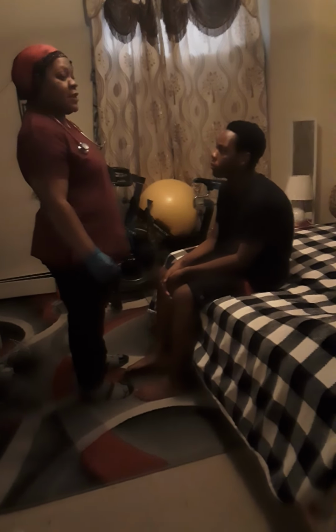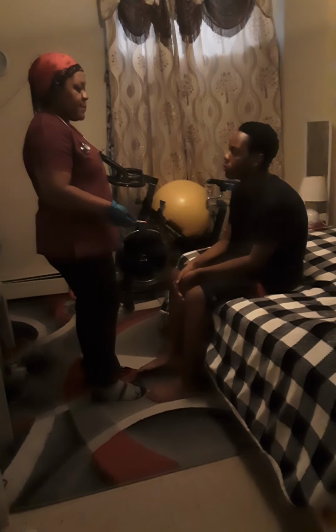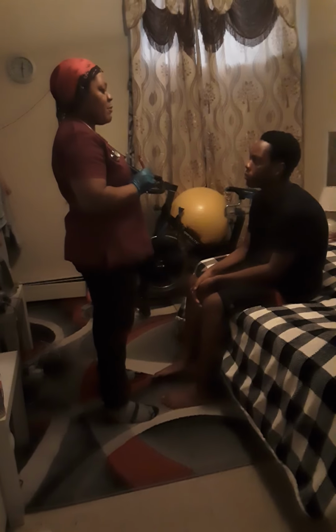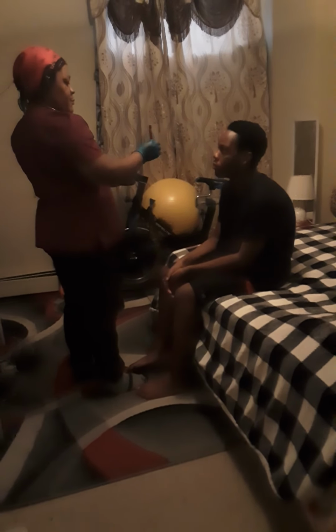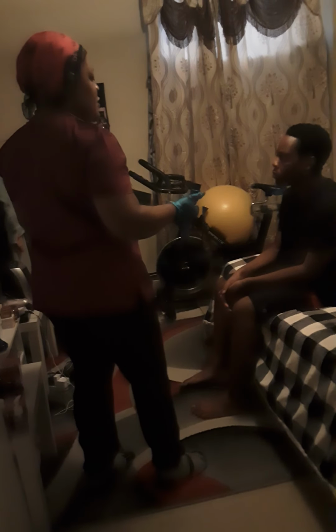Now I will test cranial nerve number 3, which is the oculomotor nerve. I'll be using the pen light, and I will have you keep your head straight, and you're just going to follow the pen light by moving your eyes, okay? Don't move your head. Now could you stare at the object on the wall? I'm going to use a pen light to shine a light on the side of your eyes, and to see if your pupils will constrict, okay? Stay straight.